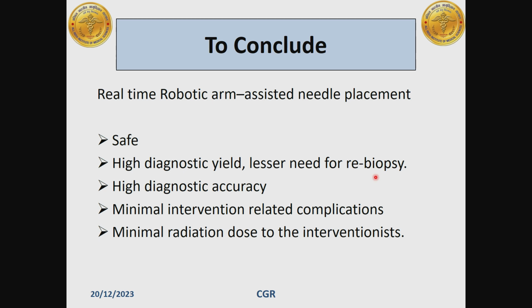So, to conclude, real-time robotic arm-assisted needle placement is a safe procedure with a high diagnostic yield and hence lesser need for rebiopsy. It has a high diagnostic accuracy. It is associated with minimal interventional-related complications and also gives minimal radiation exposure to the interventionist.